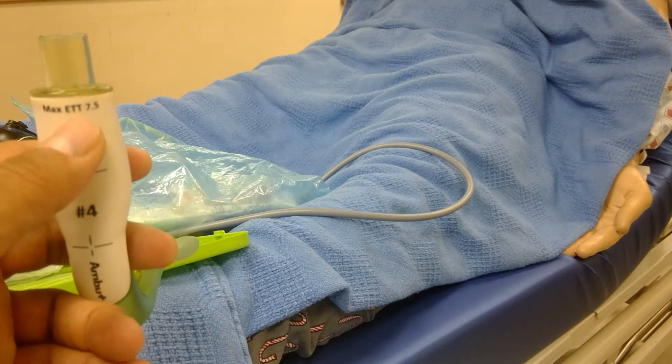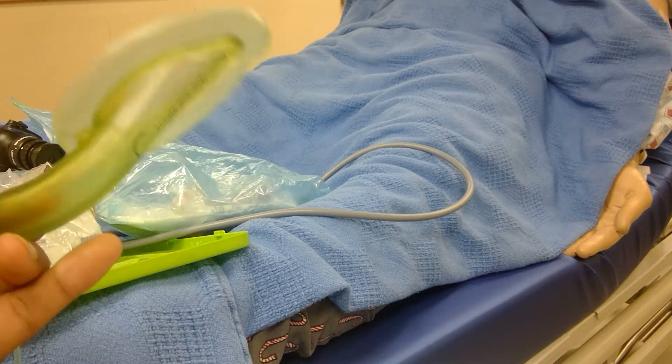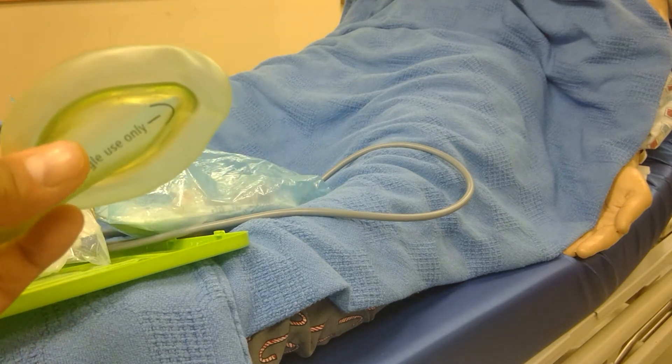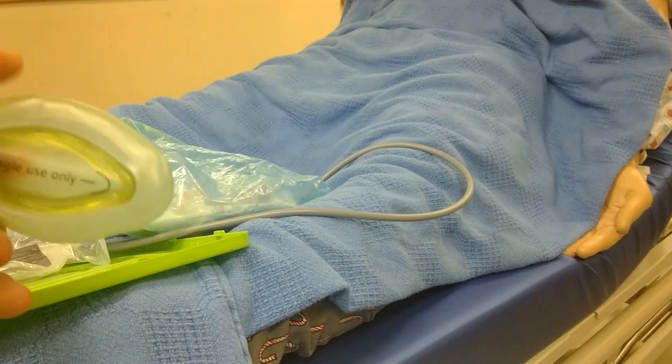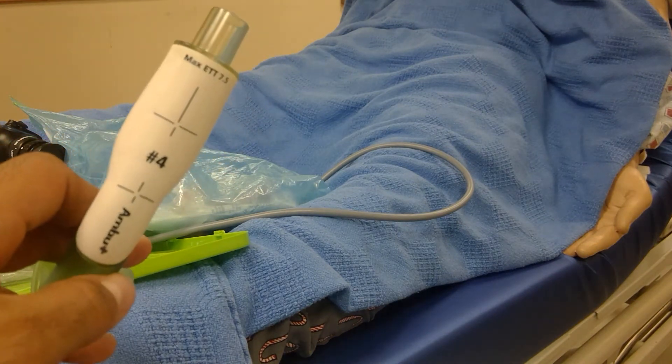It has a pilot balloon — which is good — and a marker reminding you of the tube size: it can allow intubation with a 7.5. The AirQ — I'd have to get another size 4 — allows gastric suctioning and decompression. It will be ideal for intubations, though I don't have the device right now.